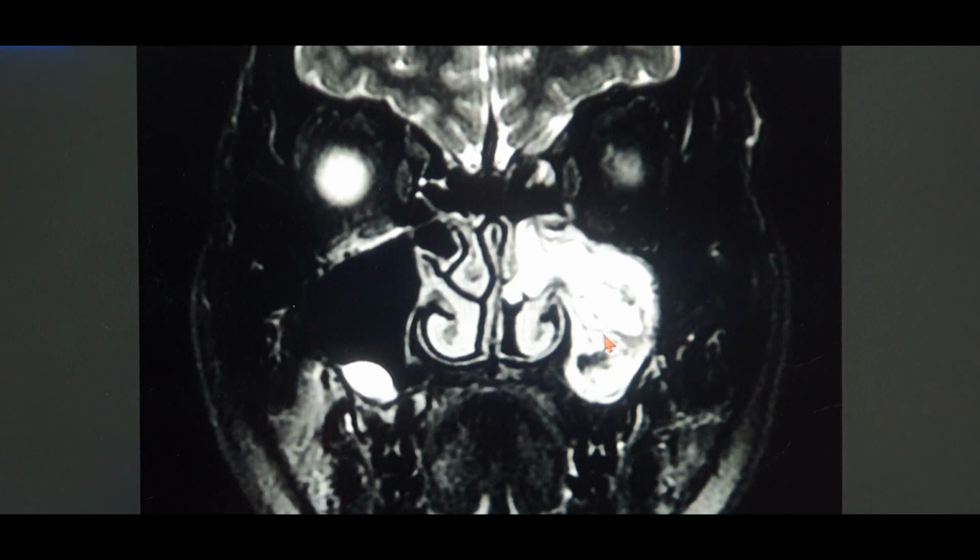Now this is the place of origin, because from here I can see all the CCPs arising and going towards the nasal side. The tumor in general will have CCPs all over it. The place where the CCP is absent, where you cannot see the CCP in some area but can see it in other areas, in short, loss of CCP, denotes malignant transformation. So that area should be taken for biopsy to know for sure that this patient has undergone malignant transformation, and it should be sent for frozen section.